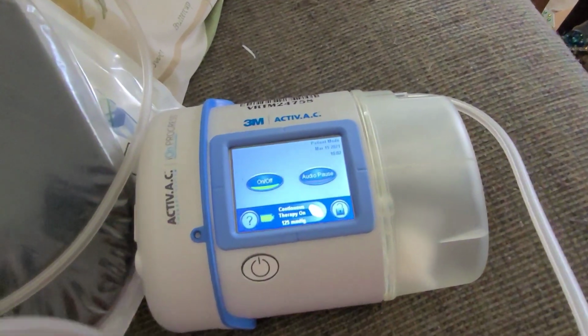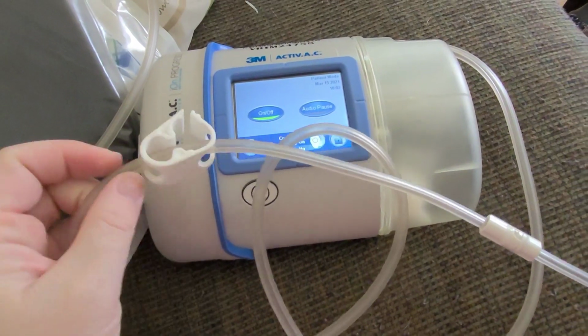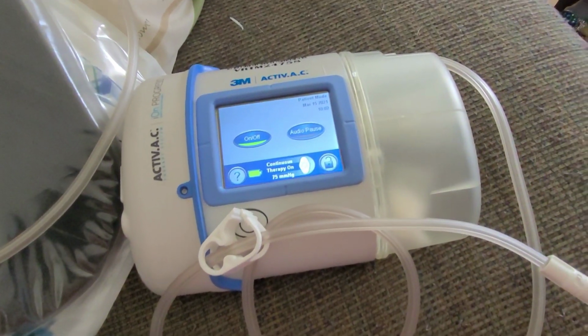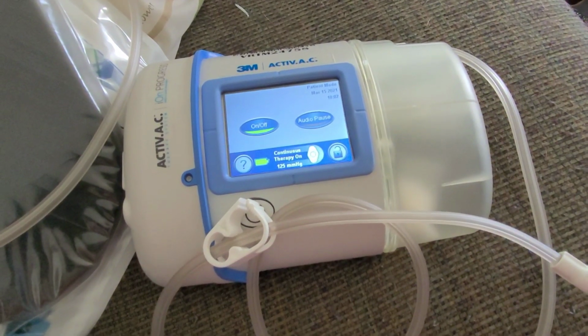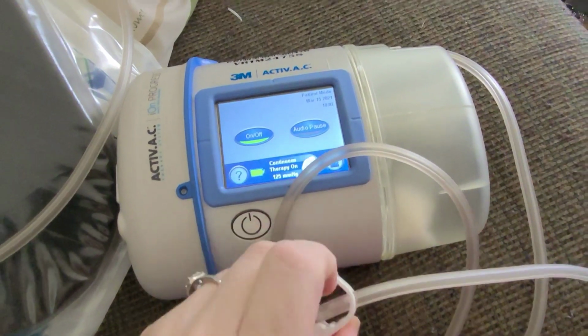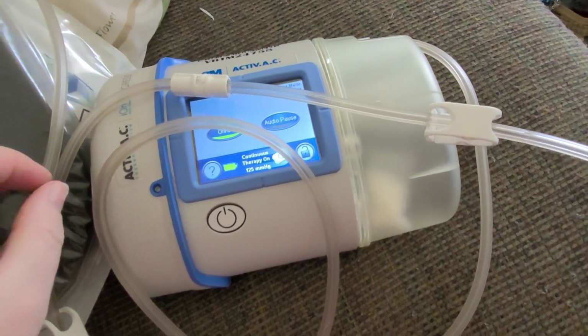So everything's put together. Everything's on. I have probably, I want to say 6 to 7 feet of tubing, which is wonderful when I'm laying down and resting, but when I'm moving around, it can be hazardous. So you have to be a little bit careful with this thing because I'm already kind of a klutzy person.